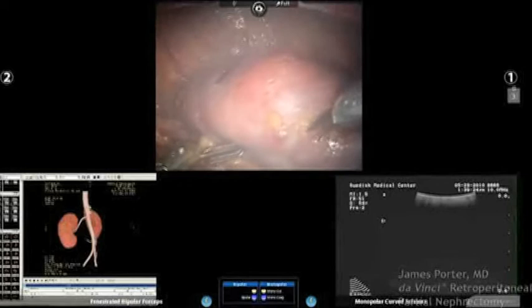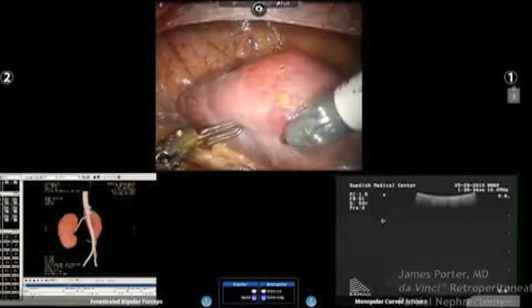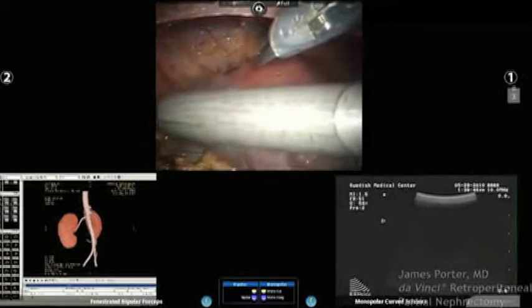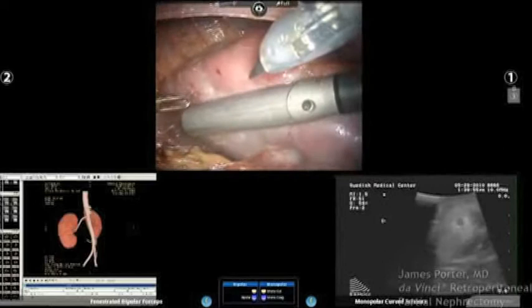Well, I can see really the benefit of the retroperitoneal approach in having this tumor right there, optimized position. If this were a transperitoneal approach, one could put a baby lap to help push that kidney forward. But also, you can see how Dr. Porter has mobilized all of Gerota's off the kidney in order to allow the optimal exposure and presentation, so that when he does reconstruct the capsule, it's all presented right there in front of him.